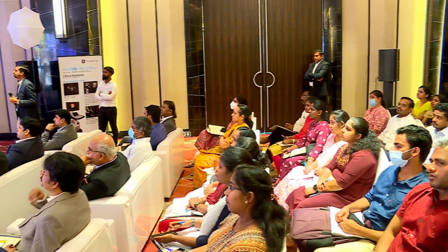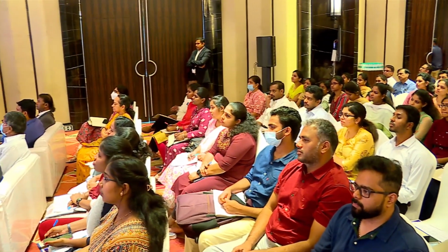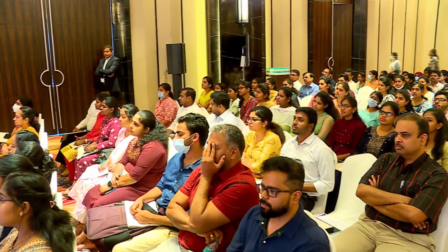Do you recommend mild, moderate, severe grading, or just say the probability as recommended by the ESC guidelines? No, if you are sure about the presence of pulmonary hypertension, there is no harm in grading the pulmonary hypertension. Anything between 25 to 30 will be mild, and 30 to 40 will be moderate. Anything above a mean pulmonary artery pressure of 40 millimeters of mercury will definitely be severe pulmonary hypertension. And this again varies in children and adults. You have to remember that.